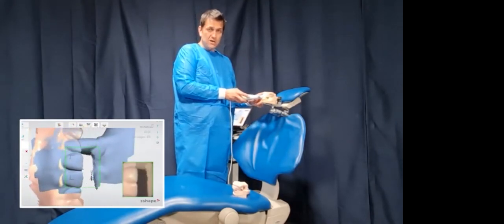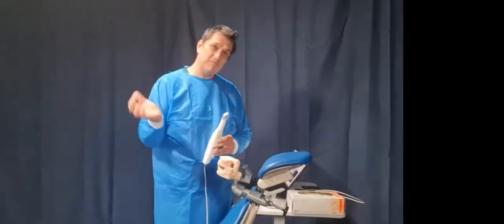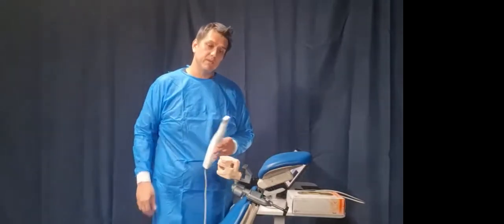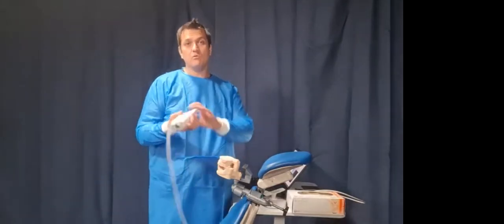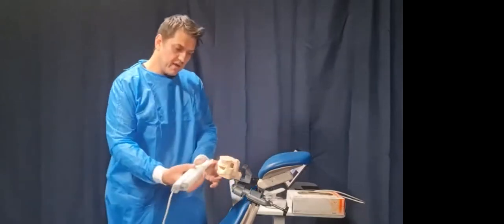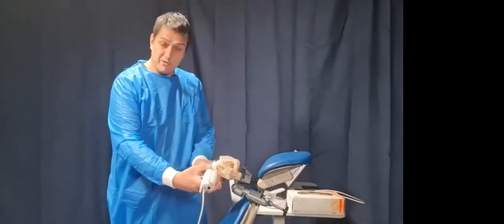Now at the midline, what do you do? You take the scanner out of the mouth at the midline. Do you push the button to stop it? No, you don't. Leave the scanner running, because as soon as you push stop, that completes your bite. So what I then do is change my hand position. I'm in this position, and I'm now reversing my position, and I can make my way all the way down the other side. So again, just on the midline, looking for a relocation point.